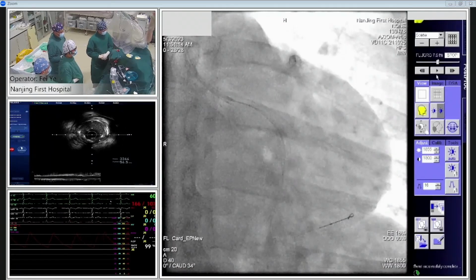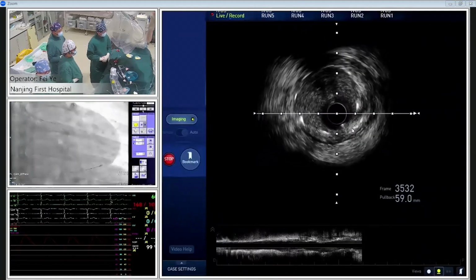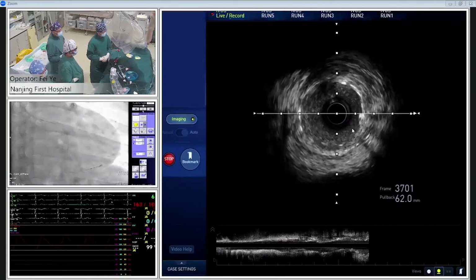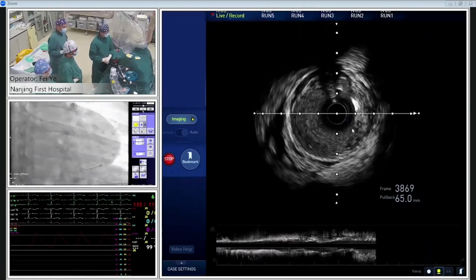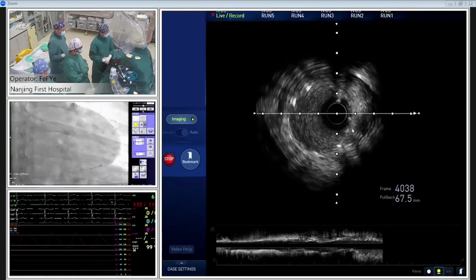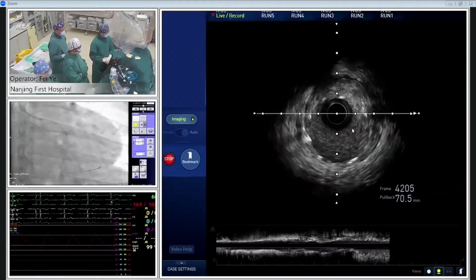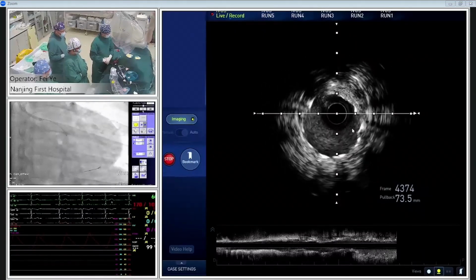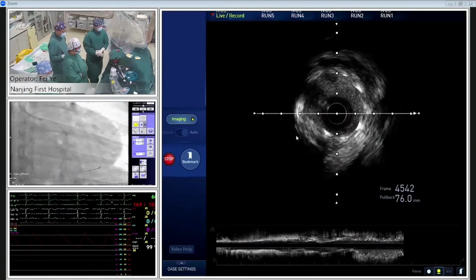It's a proximal circumflex. Stent mean diameter is more than 3.0. Just below the first bifurcation lesion, I think. You cannot see the OM1. It's not coming. Not found it. One moment, maybe it's coming now. This is OM1. Yes, we can see. I think the result is quite good.